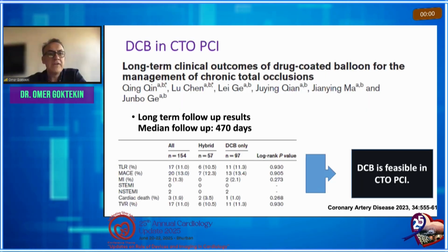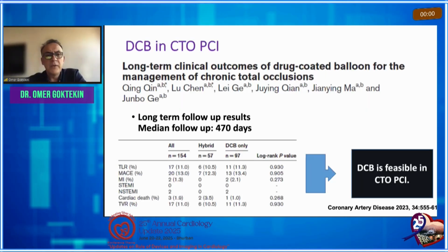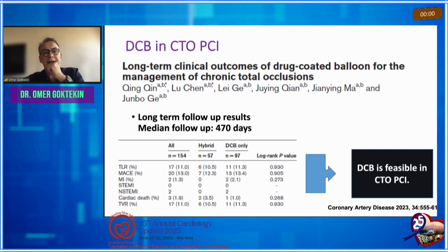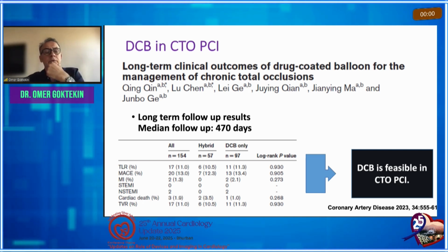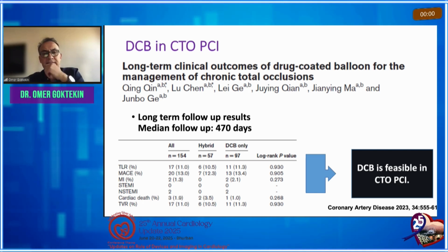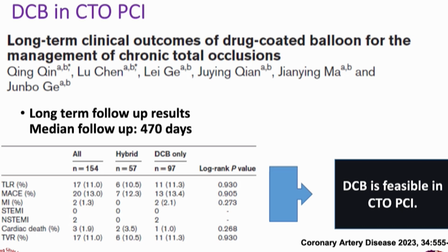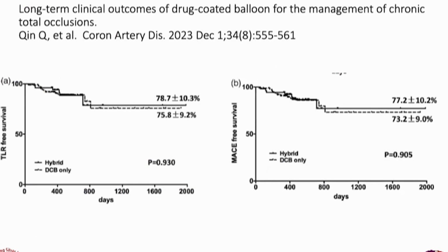We have studies. This is a long-term result. The number is not big, 154. They followed up for 470 days, and they published that DCB is feasible and safe. And another study, this is a bigger number.